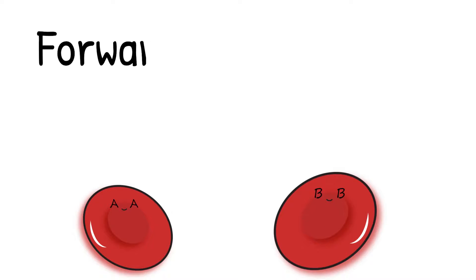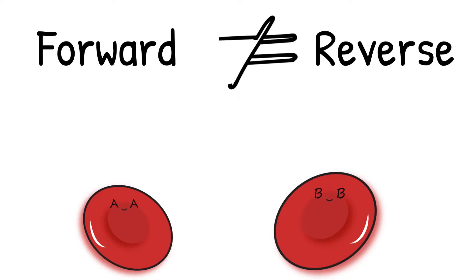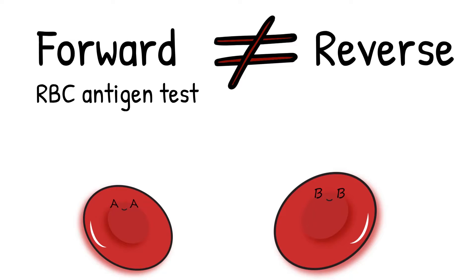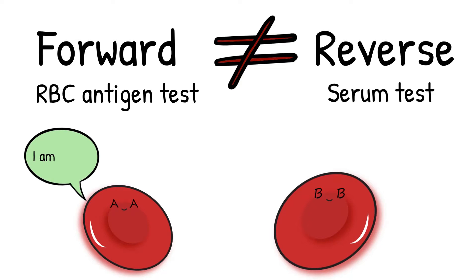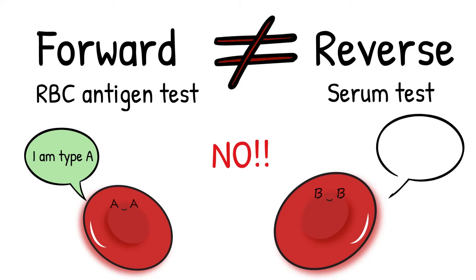In the previous weeks, we have been talking about ABO discrepancy. A discrepancy exists when the results of the forward and the reverse don't agree with one another. The patient blood type is not conclusive, so before we can assign a blood type to a patient, we have to solve this problem. Also, before we can give a type-specific blood to a patient, we have to solve the ABO discrepancy problem first, because we want to provide safe and compatible units for the patient.